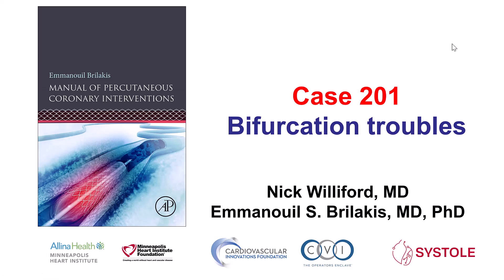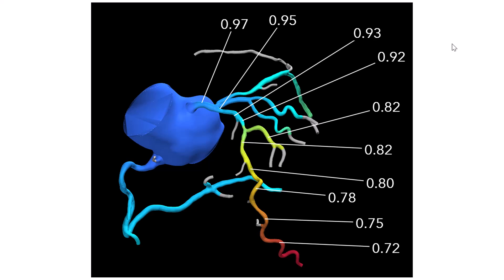This is Nick Williford and Manos Brilakis presenting case 201 for the Manual of Percutaneous Coronary Interventions. This is a case that had difficulties with treating an LAD diagonal bifurcation. The patient presented with angina and had a coronary CT screening test. This is the FFR-CT, showing hemodynamically significant lesions in the LAD with a distal FFR-CT of 0.72 and a significant drop between the proximal and the middle LAD at the bifurcation of a diagonal branch.